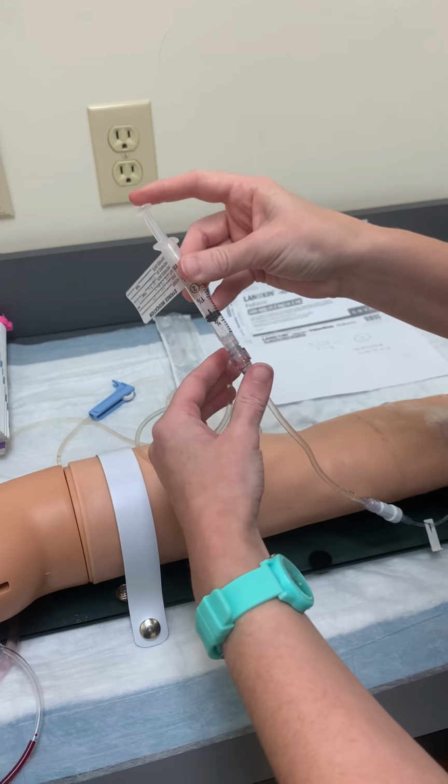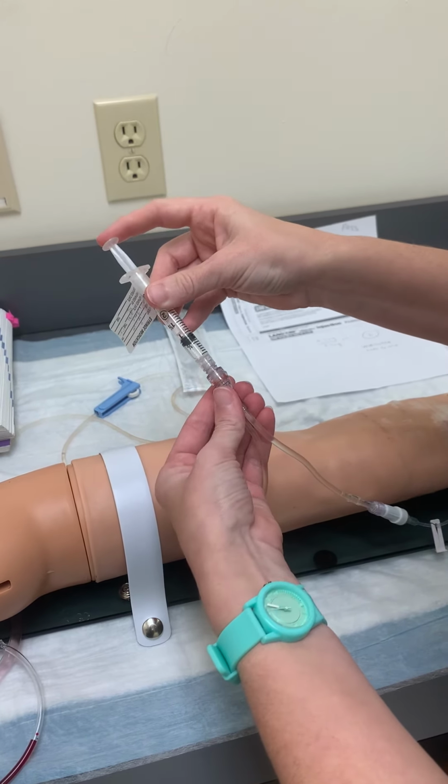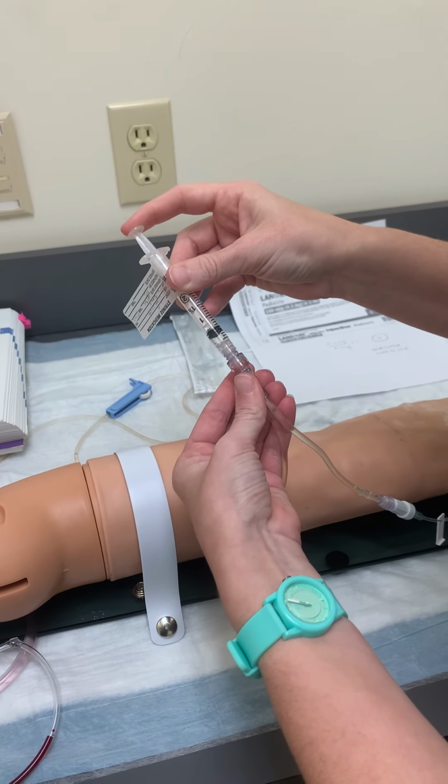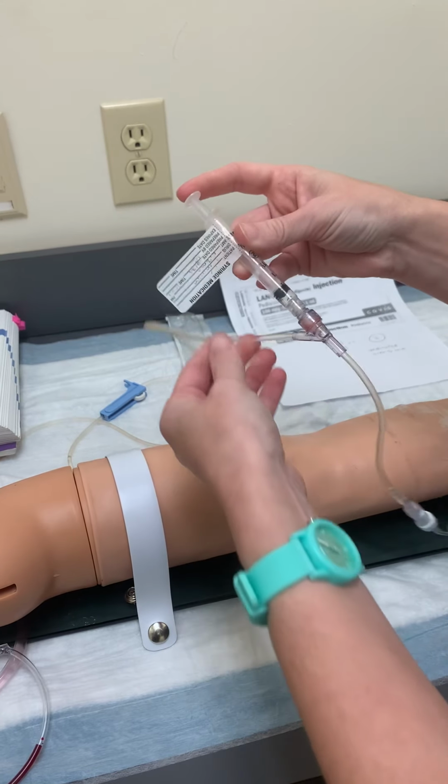Alright, back at 12, clamp. 1, 2, 3, 4. And open it back up.